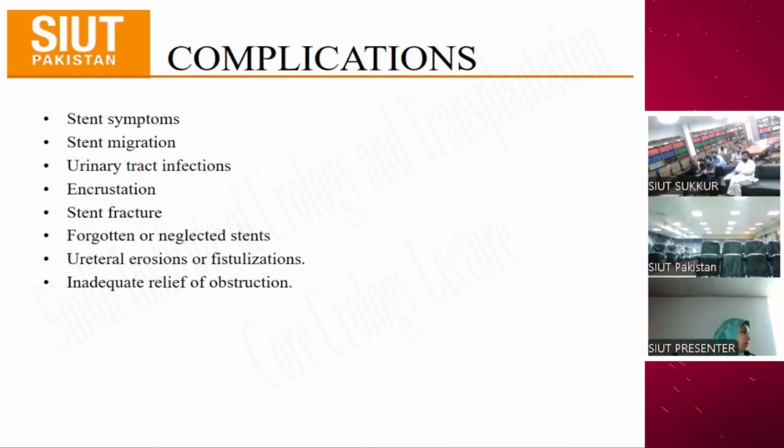Now, there is always a question in everybody's mind that if a DJ stent is there in the system for a very long time and nobody knows how long that time is, maybe it is like 3 weeks, or it might be 3 months, or maybe 1 year, but there is no consensus on the time period. Perhaps it depends upon the bacterial load. If the causation is a urinary tract infection, but most of the cases of encrustation happen at those points of the stents where you see markings.